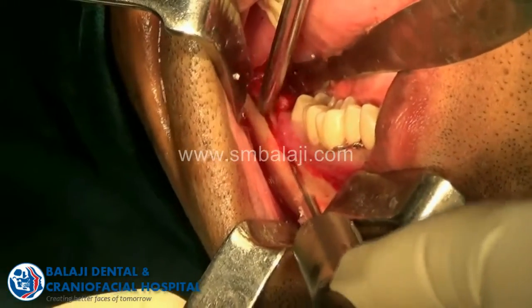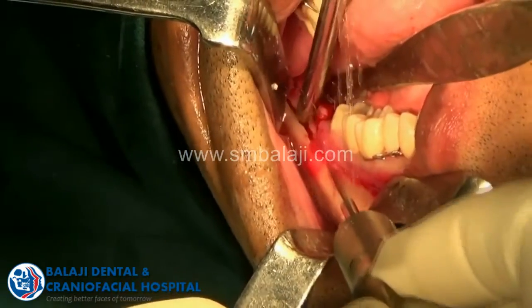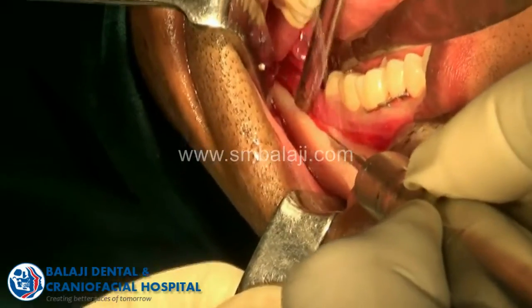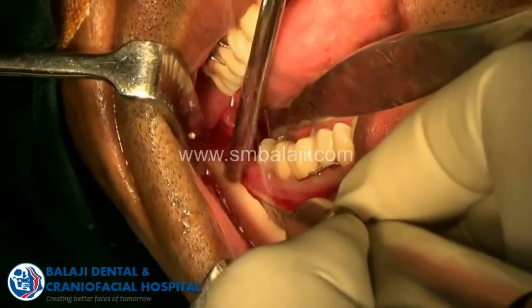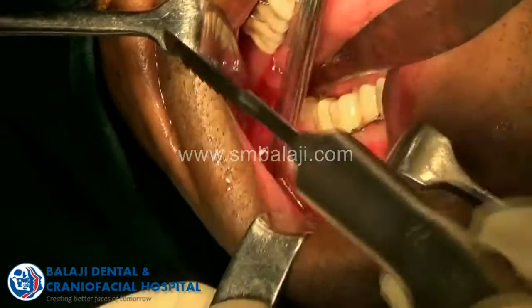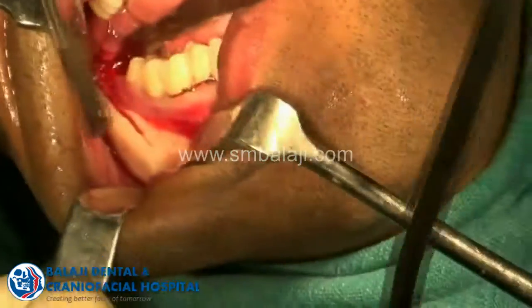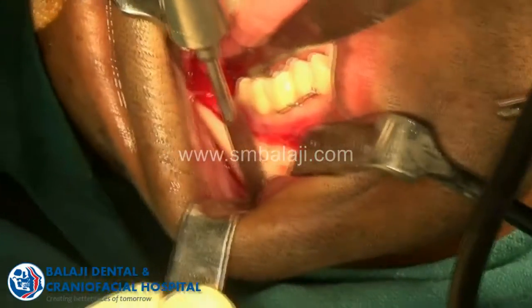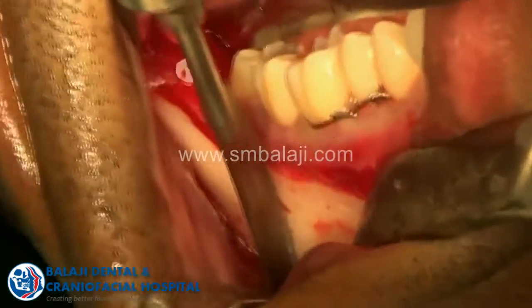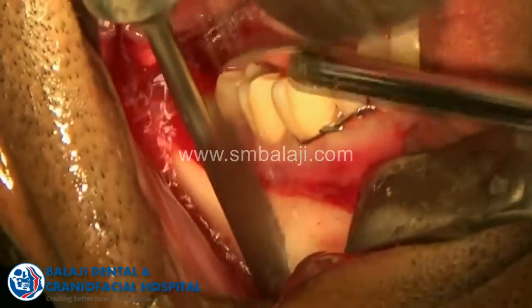You can see me making the bone cut using the saw. From the X-ray or the 3D CT you can determine how much depth to go and exactly where the inferior alveolar nerve is located. Once you make the bone cut, you can use a chisel or osteotome to split the mandible.